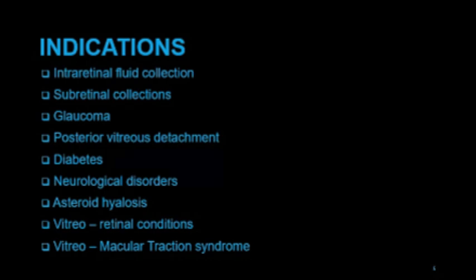So in cases of diabetes, for instance, a general practitioner might be managing someone for diabetes for some time, and then he refers to your facility for you to do OCT, because it is not just helping you as the optometrist to know what's going on, it also helps the general doctor to know the extent of the damage caused by the diabetes. Are we together? So these are the indications, and whenever you see this, you know that you ought to send for OCT.